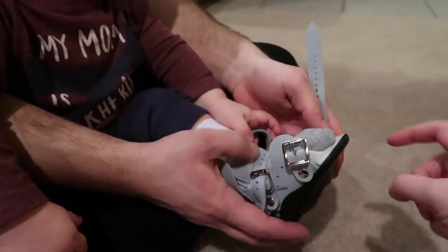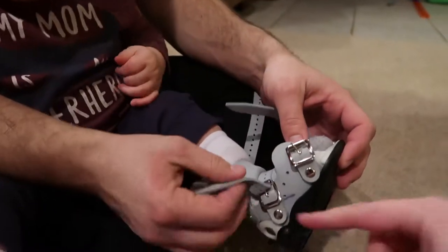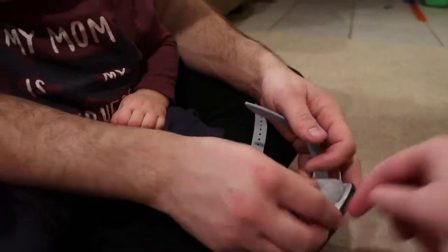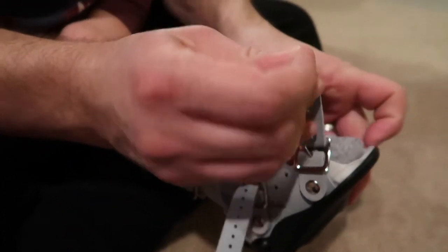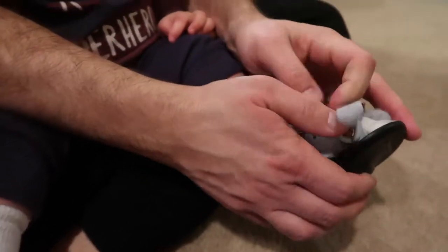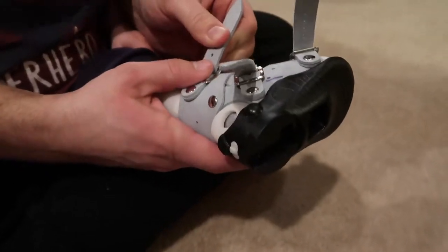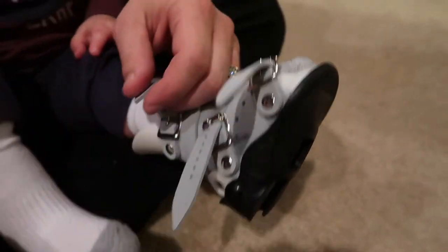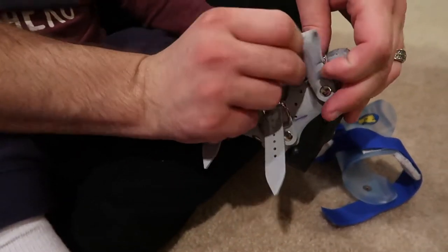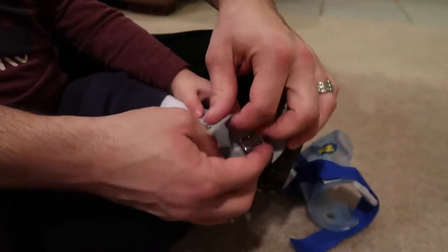You always start with the middle one because you want to keep that heel all the way back into the boot. You don't have to buckle at first — just get the tightness right. Our doctor who fit us for these put markings on ours so we have an idea of where they were, though they're not always the same because his foot changes. Then you can buckle them after you've got all three set.